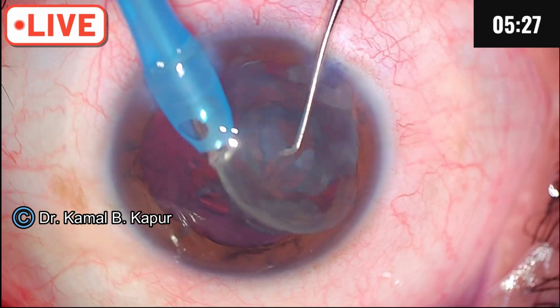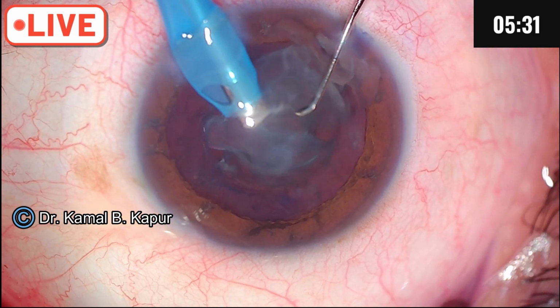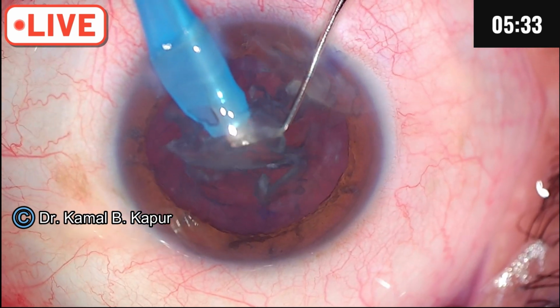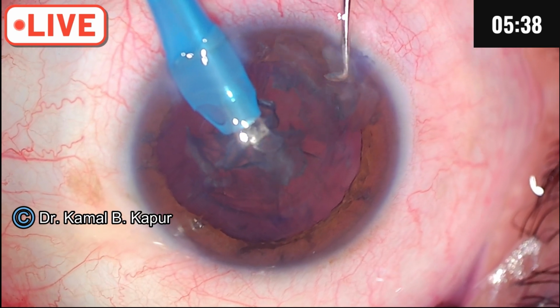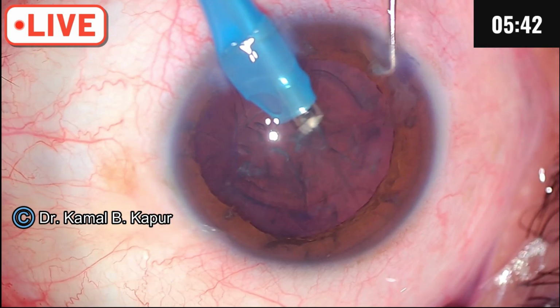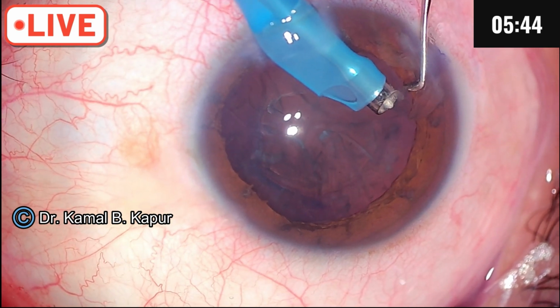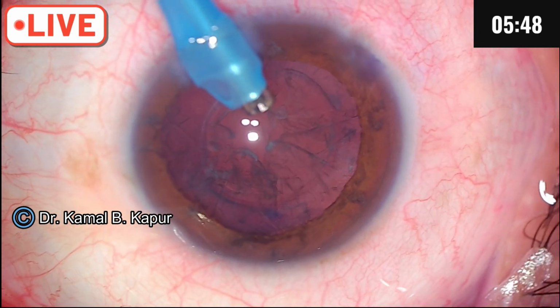You have to be very careful at this point because the vitreous will try and come out from the subluxation. No pressure fluctuation. So just before your occlusion breaks, reduce your vacuum. Visco ready.